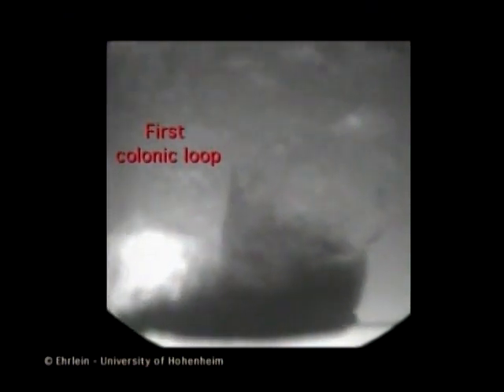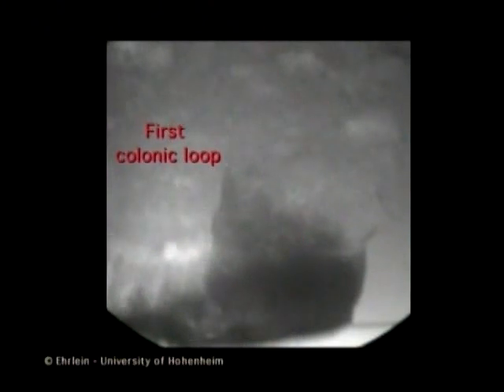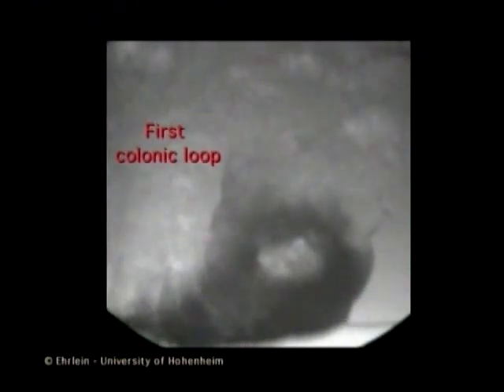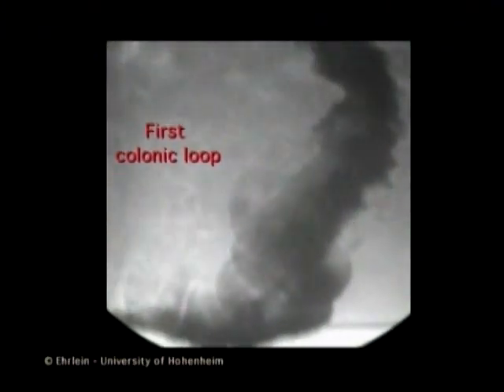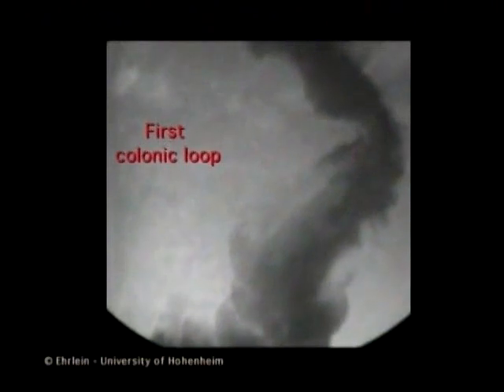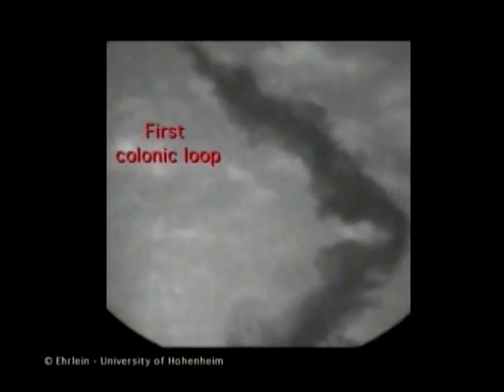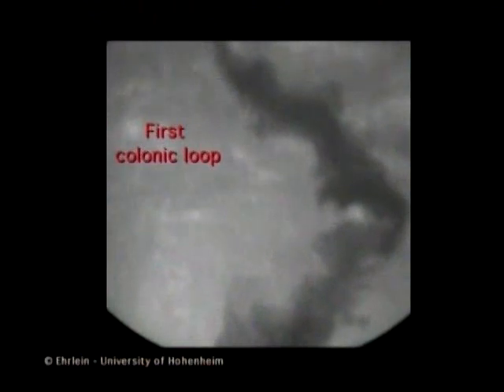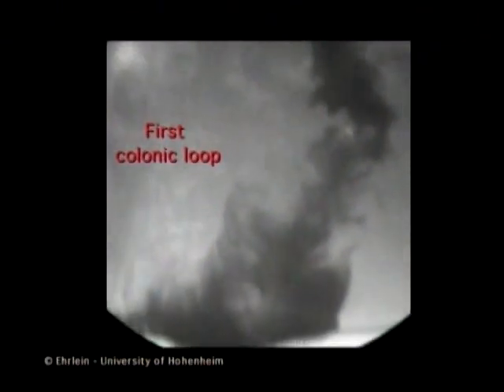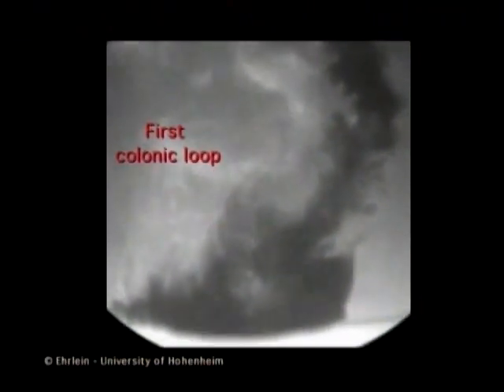A peristaltic wave enters the loop and propels the contrast medium distally. Now the colonic loop becomes visible. The small trail of the contrast medium indicates that the flow predominantly occurred in the centre of the loop.